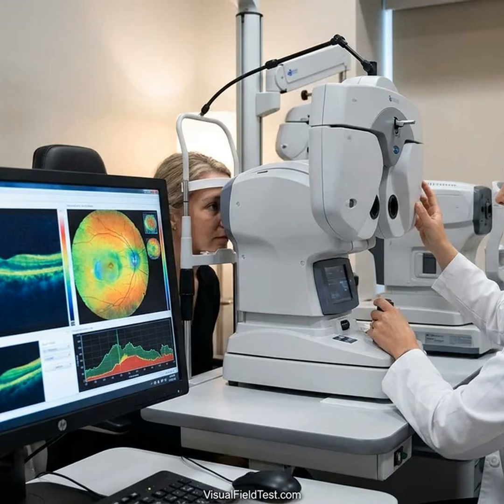Common issues that can mislead OCT results. OCT scans are powerful, but they have pitfalls. Several common factors can cause misleading results. Poor scan quality. Blurry images from blinking, poor tear film, or patient movement can skew measurements. If the scan is not well focused or is cut off, the thickness numbers may be wrong. Most machines give a quality score. A low score should alert the doctor to rescan.